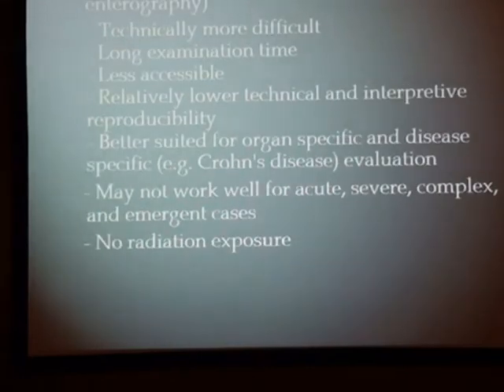MR enterography compared with CT is technically more difficult, has long examination time, is less accessible, and has relatively lower technical and interpretive reproducibility. It is better suited for organ-specific and disease-specific evaluation, such as Crohn's disease, may not work well for acute, severe, complex, and emergent cases, and has no radiation exposure.